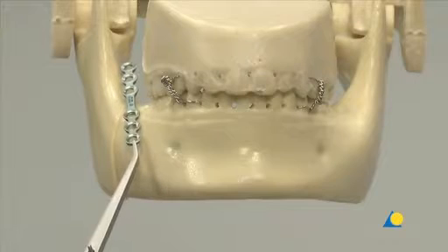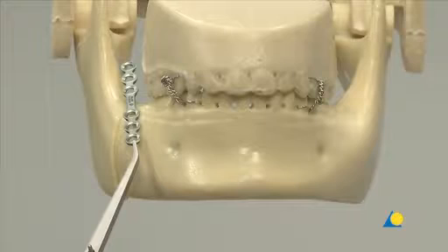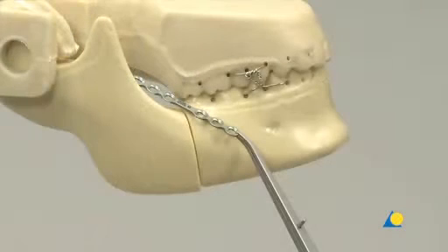A 6-hole, 1.0 mm thick matrix mandible malleable miniplate with center space is placed on the oblique ridge of the mandible along the ideal line of osteosynthesis as described by Schompe. The plate must allow for at least 2 screws in each main fragment and sufficient distance between the fracture line and the closest screw hole. In this exercise, non-locking screws will be used. Locking screws can also be used, but to do so one must use a drill guide that centers the screw within the plate hole.